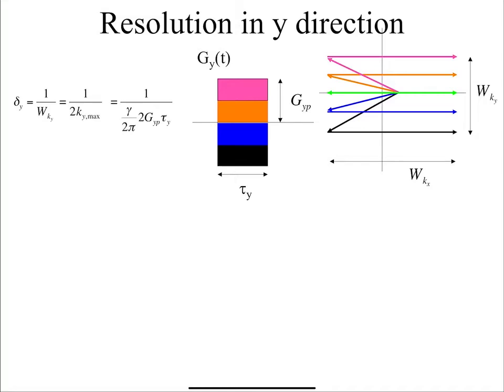But that's going to give me 257 steps. We'll talk later why you can actually skip one of the ones below or on top. But for now, just think about 128 below, 128 above. Unless you're told otherwise, and that's actually what's shown here, we're taking 2 steps below, 2 steps above, and you can just use that for your equations and design problems.